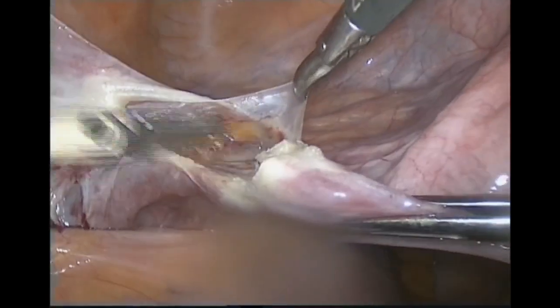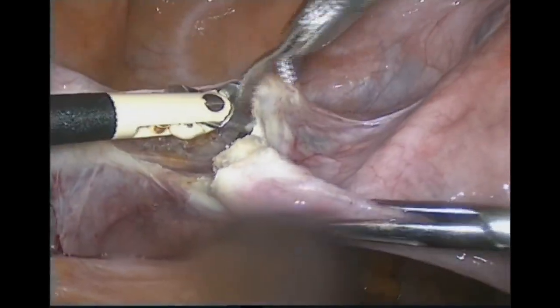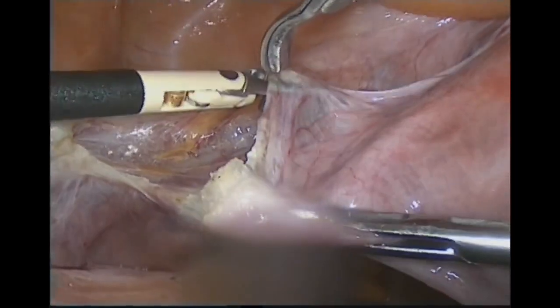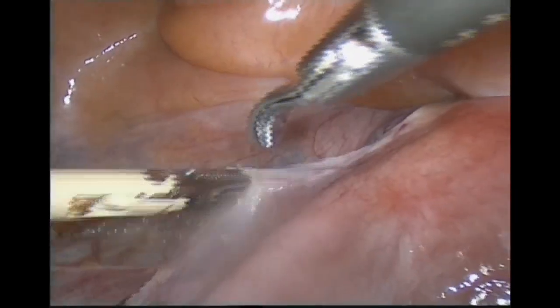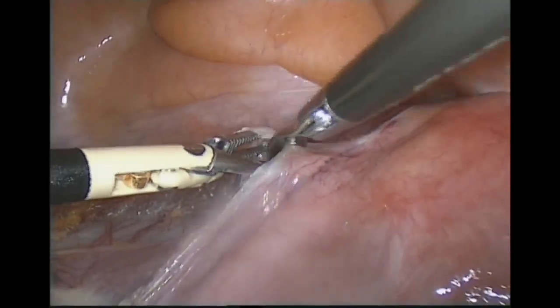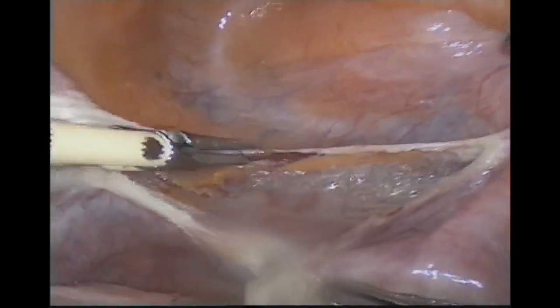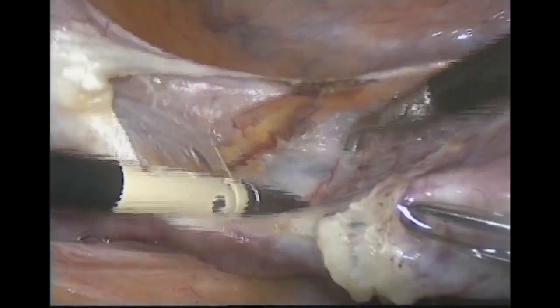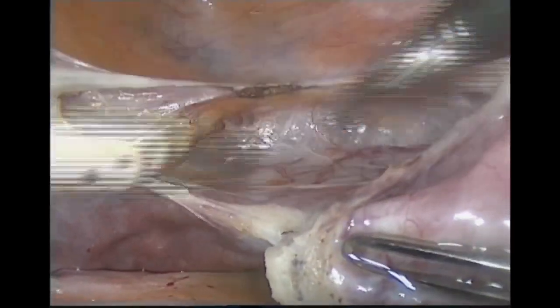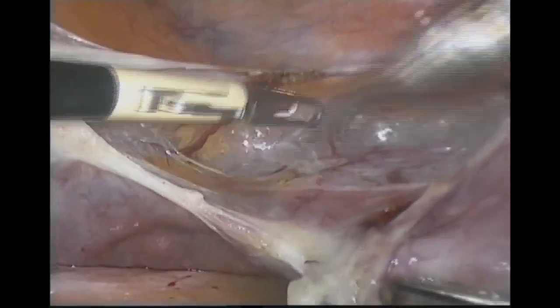Start with the round ligament toward the pelvic wall, catch the round ligament to mobilize the uterus. Coagulate and divide with simple bipolar to open the broad ligament and the retroperitoneum. Go toward the bladder flap.